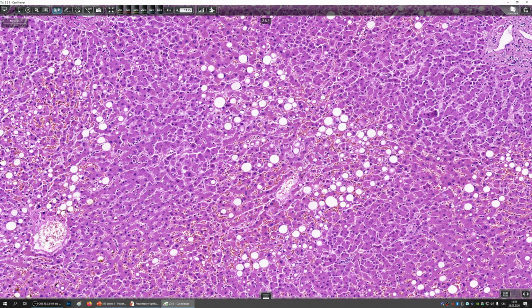This is a sign of chronic hypoxia. As you know, in order to metabolize fatty acids, you need to perform the so-called beta oxidation, and this beta oxidation is highly oxygen intensive. So if you have chronic hypoxia around the central vein, then logically this reaction will not be able to move forward, and the metabolites, the triacylglycerides and free fatty acids will accumulate, leading to steatosis. This is in a nutshell why the free fatty acids and triacylglycerides accumulate within the hepatocytes. So this is one more reason for steatosis.